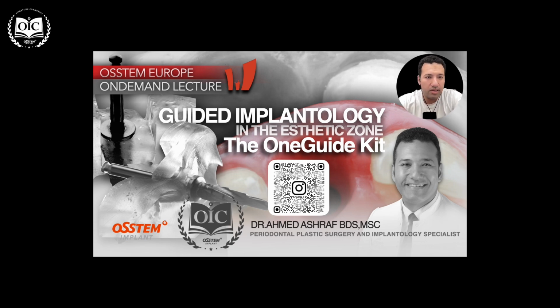I'll be discussing an interesting topic that intrigues many young clinicians and implantologists: guided implantology in the aesthetic zone, concerning the use and making the best benefit out of the OneGuide Kit. I've been using it for 2 years so far, and I've been pretty satisfied with the experience.